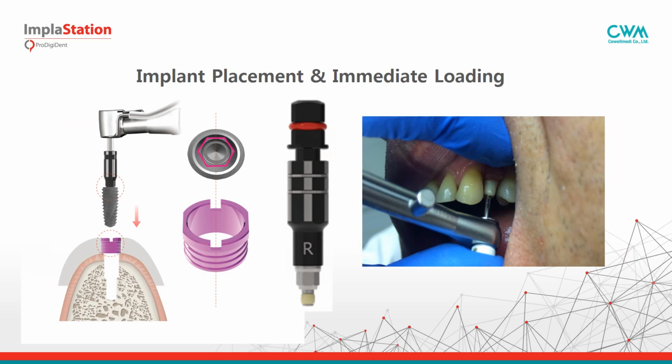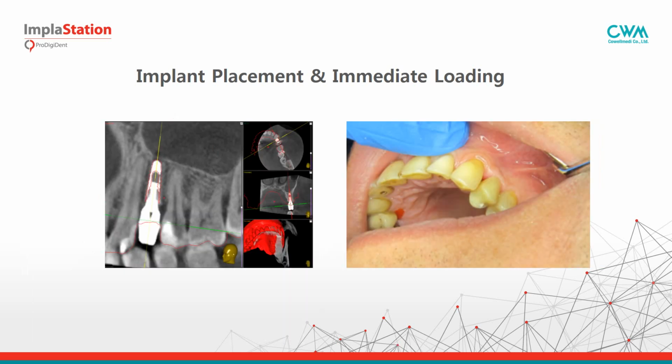The last important point: how to install the implant at the planned position. For immediate loading we need to control not only the XYZ implant position but also the rotational position. For this, Cowellive provides sleeves for the fully guided protocol with special grooves as rotational markers. Proper markers are placed on the implant driver also. These are the final images of this case.